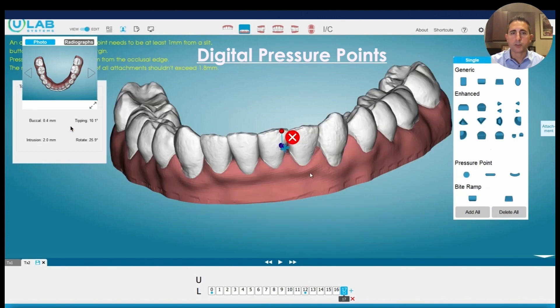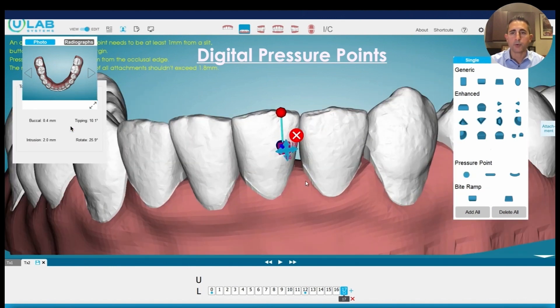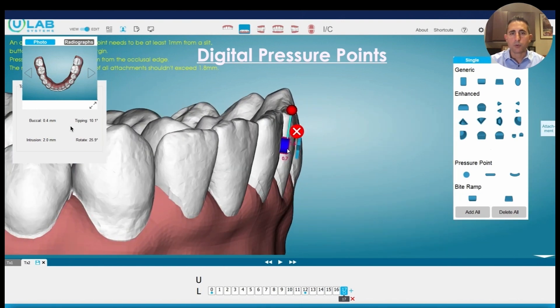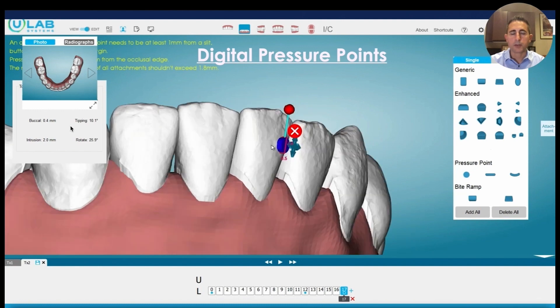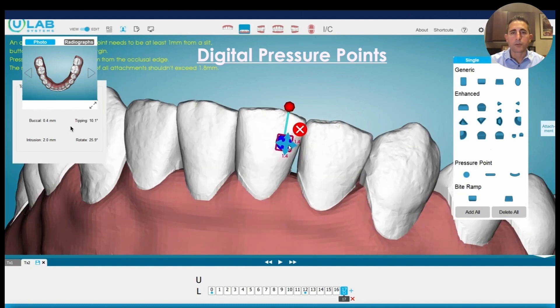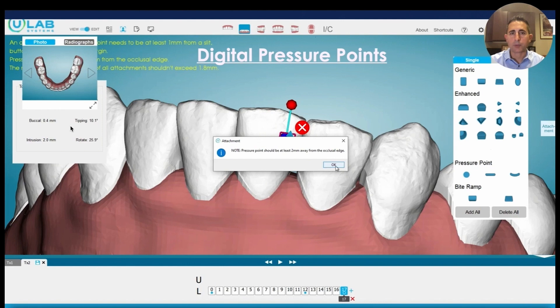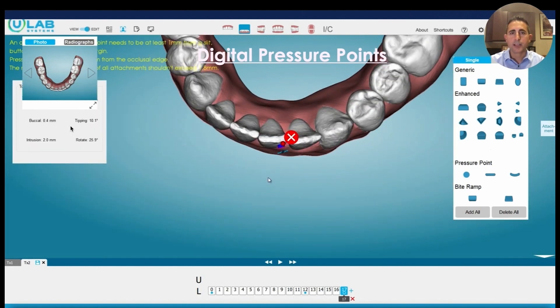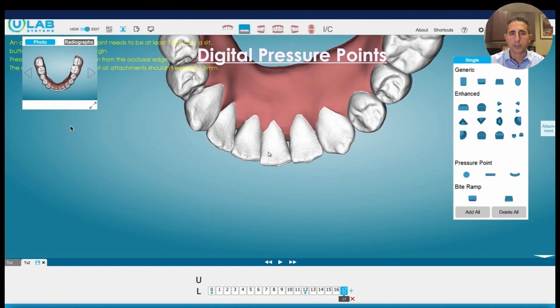What those pressure points are going to do is essentially create a dimple in the tooth. They're very simple to add through the attachment pane. You go ahead and grab the pressure point, make it as big as you want. Typically I make them about a millimeter and a half wide. You don't need more than about a half to three quarters of a millimeter of depth on these in order to provide adequate pressure. I'll place them approximately a couple millimeters from the incisal edge, on the tooth surface where I want the increased forces to be.